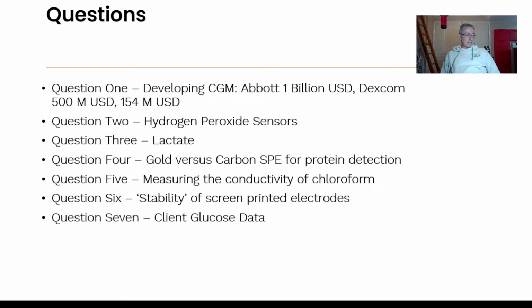With the glucose data, I think the potential that's been applied to this generation 1 glucose sensors, it's a reduction current that you're showing me. I think it means that there's a reduction potential being applied, so I think that needs to be changed to 650 millivolts. If I'm making a mistake, I apologize and we'll sort it out.